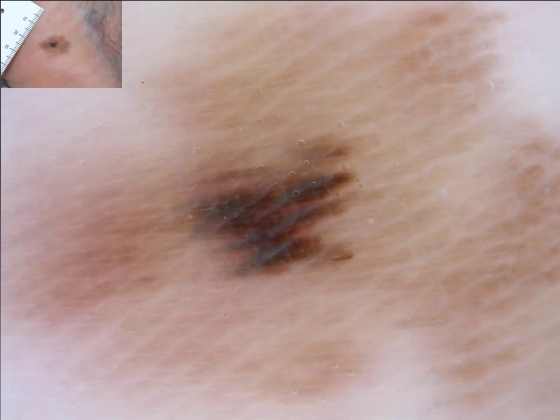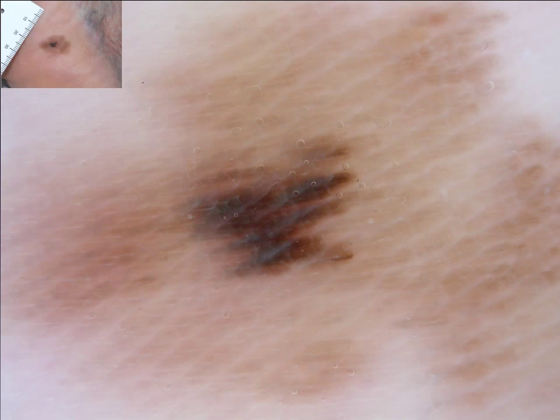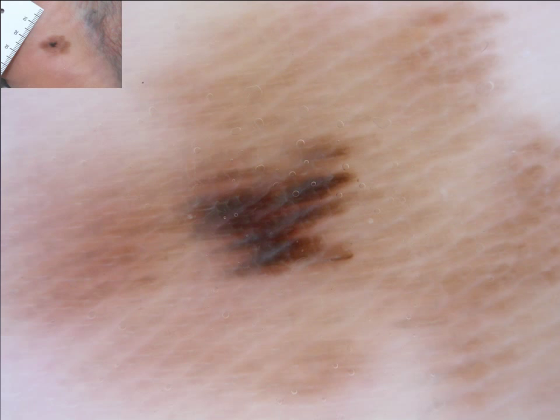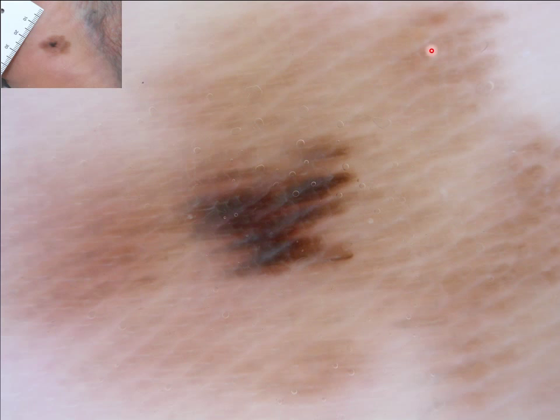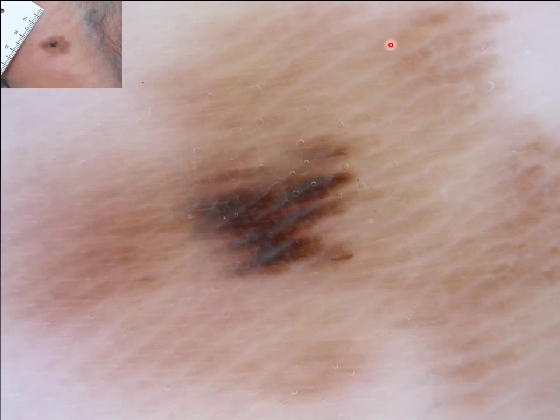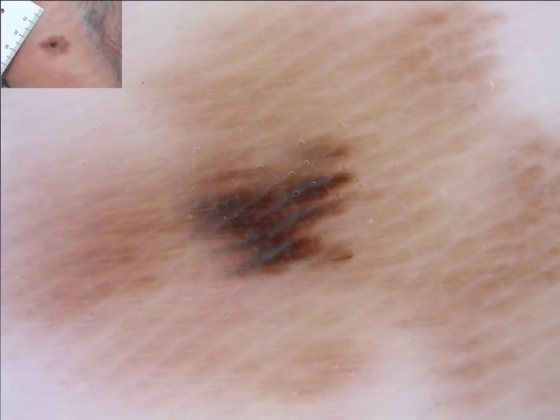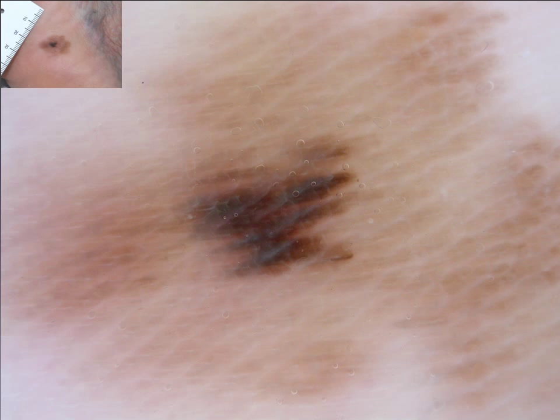Here we see another large lesion on the sole. In dermoscopy we again have to look where the ridges are and where the pigmentation is. The ridges are more heavily pigmented, while the furrows in between are non-pigmented.